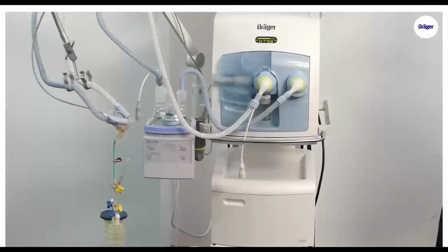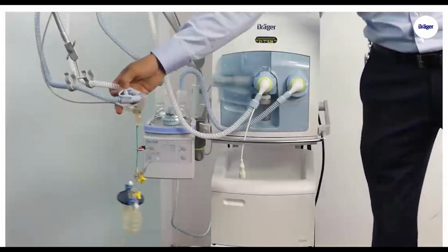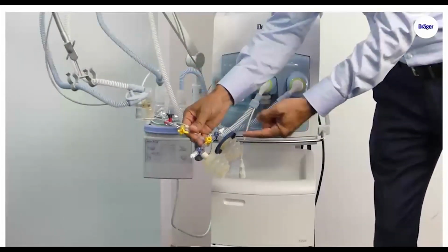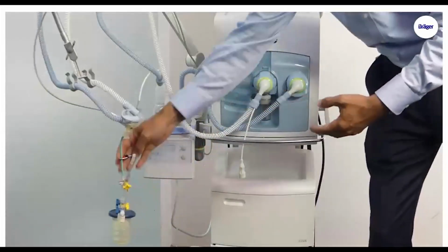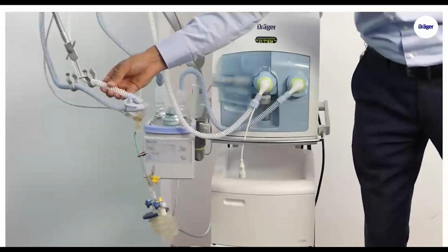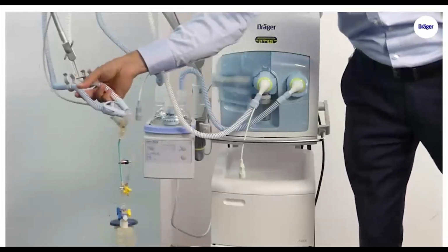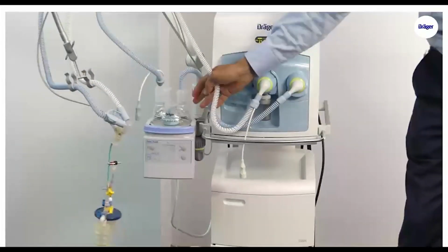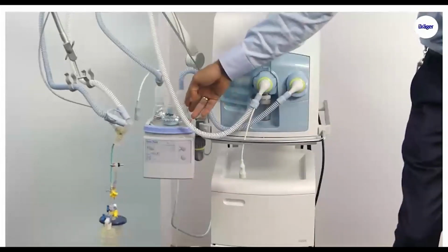Furthermore, I would like to explain a little bit about the setup here. We are using a test lung with 2 bellows within a T-tube. We have connected this to a low compliant patient circuit, which nevertheless is very flexible, but has a low compliance, which is important for the power of high frequency oscillation. Then we see a low compliant humidifying chamber to optimize the output of the ventilator.